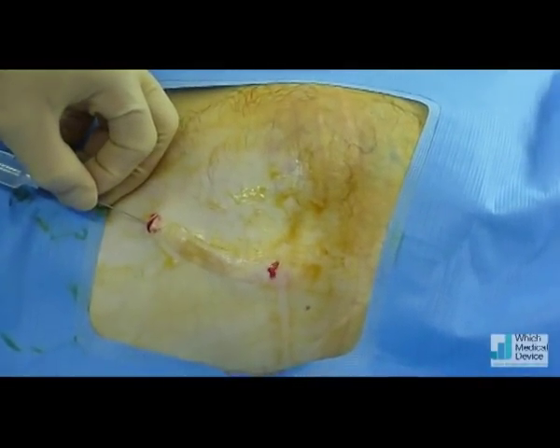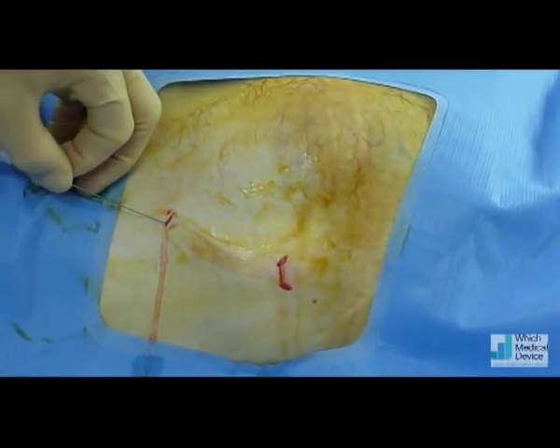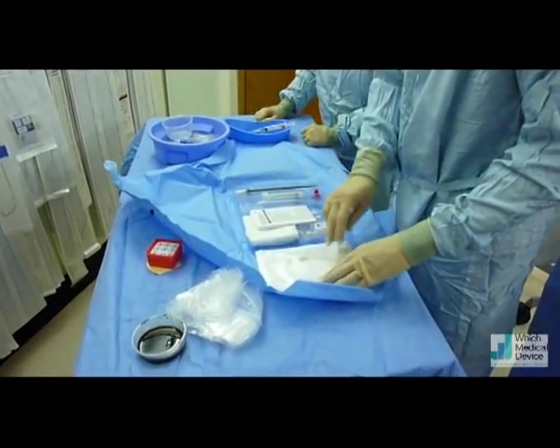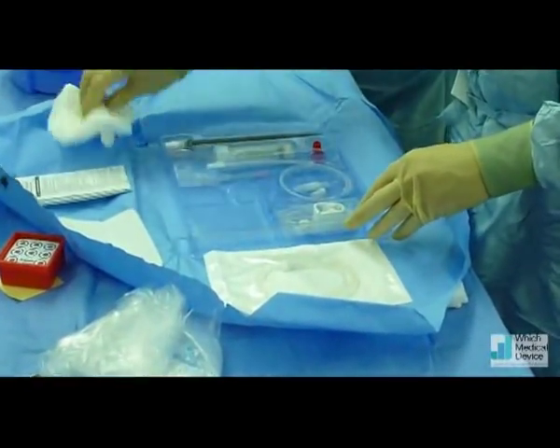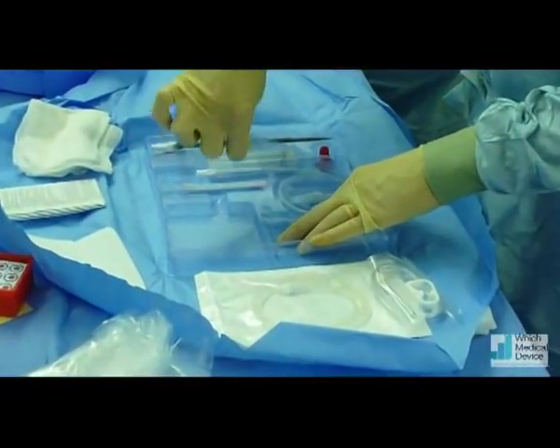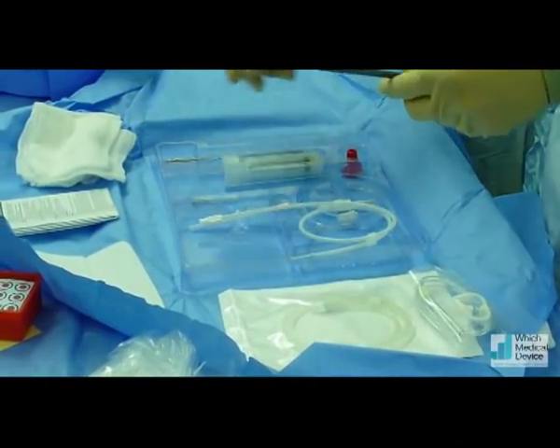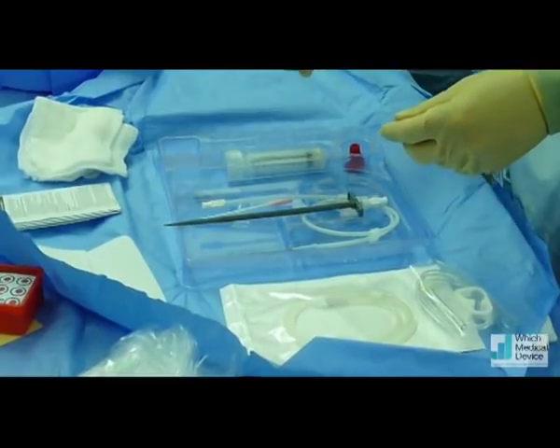It might sting a little bit — it's just more anaesthetic going in. That's the PleurX kit. That's the PleurX drainage catheter itself. Dressing for when we're finished. Some gauze. Connection tubing. That's our Seldinger needle, along with the guide wire, the peel-away sheath. And this kit actually has a metal tunneller — a lot of the kits come with a plastic tunneller as well.